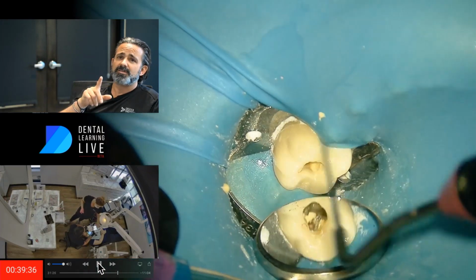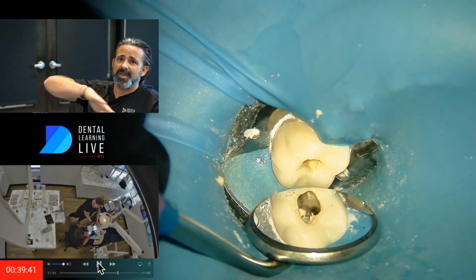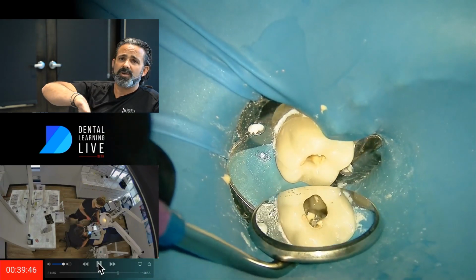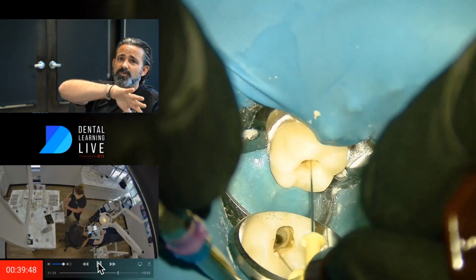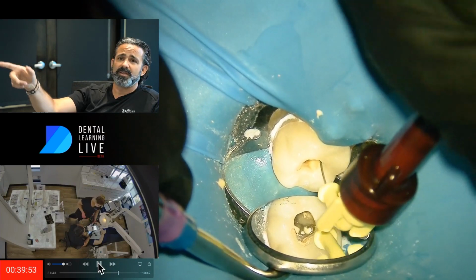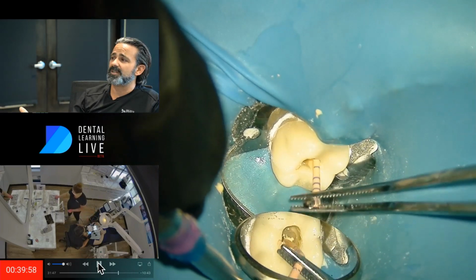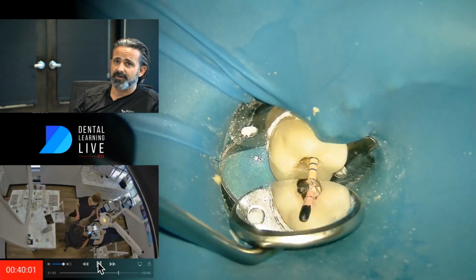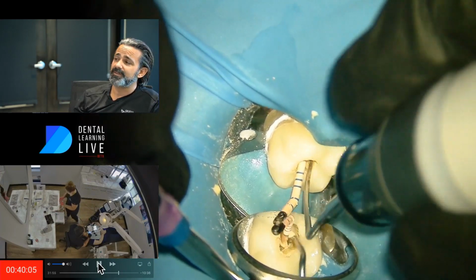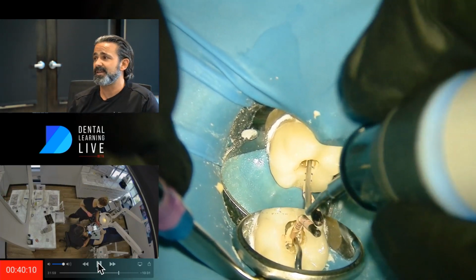But let's just pretend I do have an isthmus that was opened up, for instance. And how did I really wick out the fluid, albeit it's water? But how did I wick that out? And the answer is you don't know unless you push from one side into the other. And so what I like to do is then wick it out with another paper point. And that's what you just observed me do on the mesiolingual canal. And then I'll just reapply more sealer and then just do a glorified or a modified continuous wave. And at this point, I'm just searing it off and down packing it and trying to push that sealer around. And that's about the extent of it at this point.